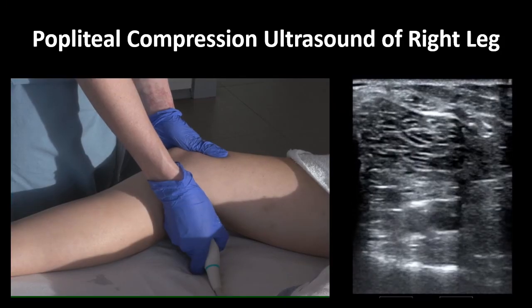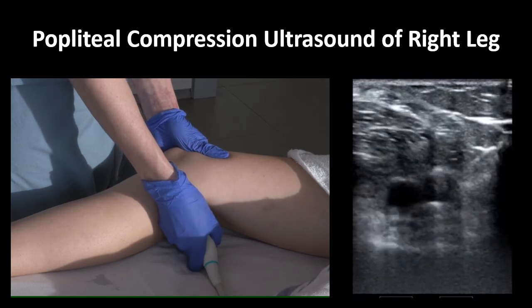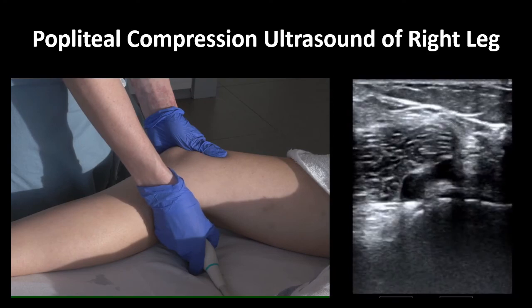Here is a close-up view of your hand position and what you should see on ultrasound. Again, notice that I'm stabilizing the knee with my non-scanning hand to provide counterforce for my compressions.